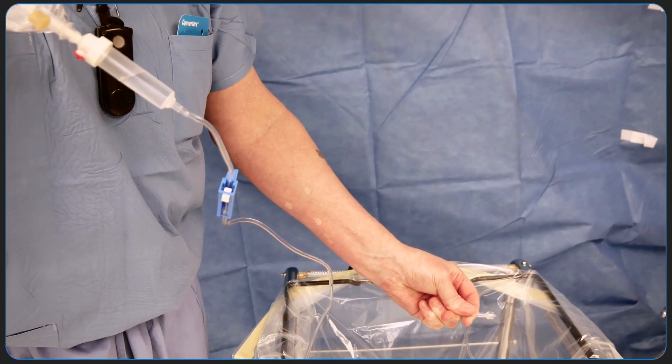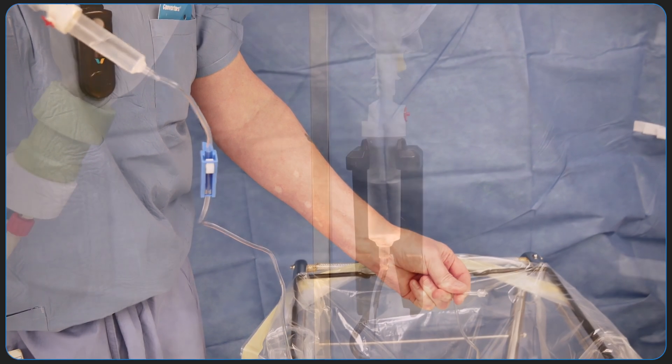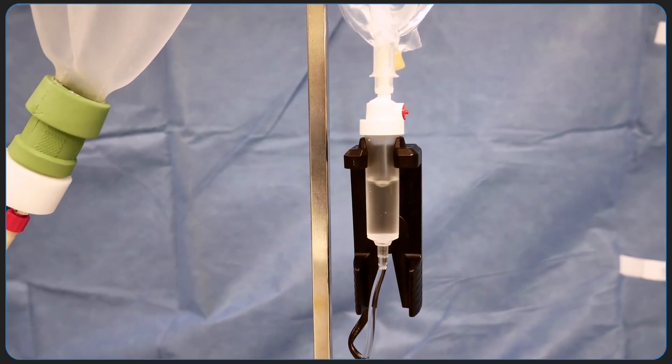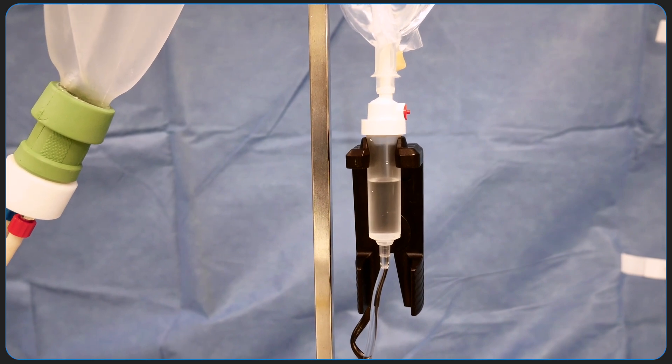Now fill the drip chamber about a third to a half of the way with water. Filling the drip chamber completely will not allow the drop sensor to detect water movement, and again the no water alarm will sound.